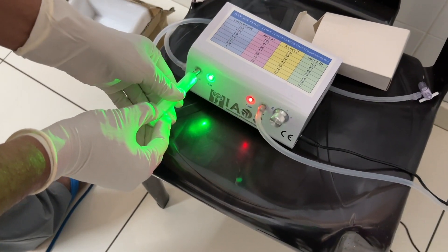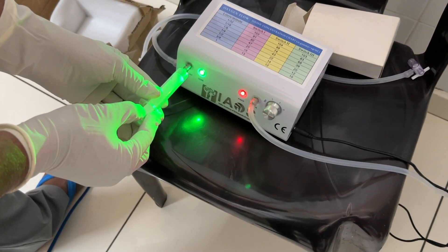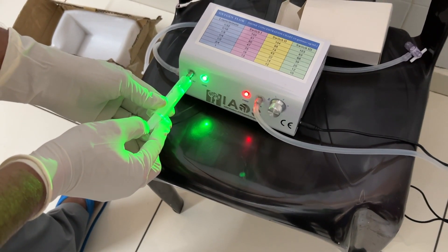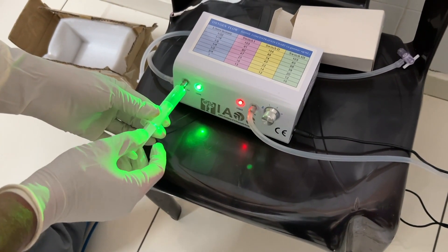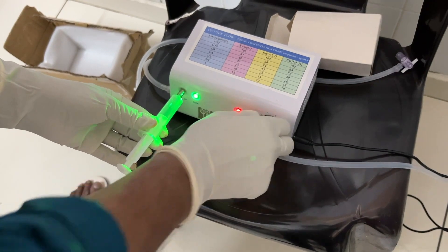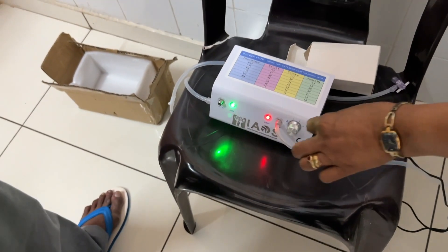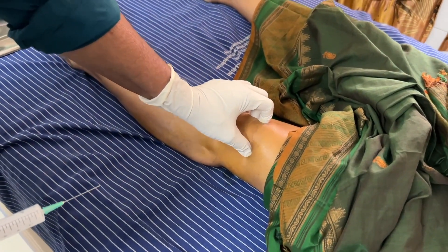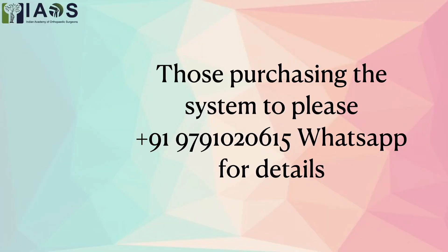I have adjusted the concentration at 70 micrograms per ml and the green light indicates that ozone is coming. You can see that ozone is being slowly extracted from the generator. As advised by my close colleague and friend Prasham Shah, 7 to 8 ml of dry ozone post injection of xylocaine and lubricant into the knee will ensure that the patient remains satisfied for a minimum of 3 months, sometimes 3 years or more. As ozone is heavier than air, it does not dissipate and we just give it as a bolus to cause arthrodiastasis or joint expansion. You can see the patient is able to move her knee immediately after the injection.